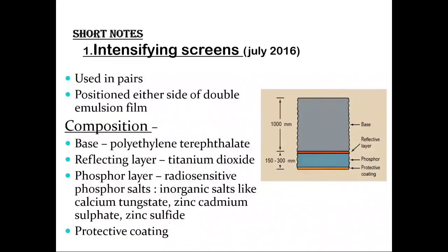And also this reflective base has the potential to increase the light exposing the film, and also results in some kind of image unsharpness. So what happens is that because of the divergence of the light rays reflected back to the film, it tries to bring out this quality.